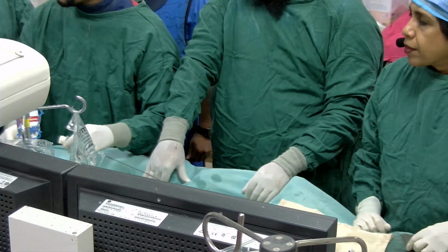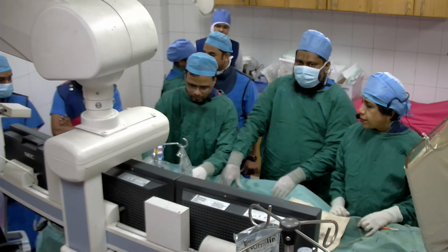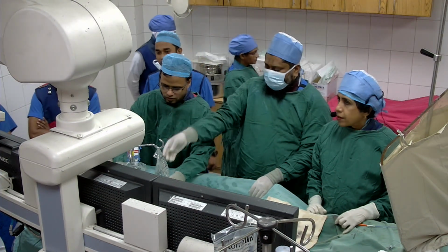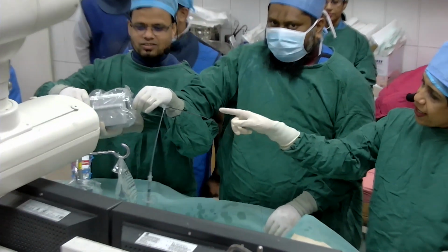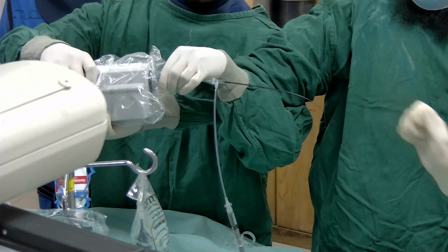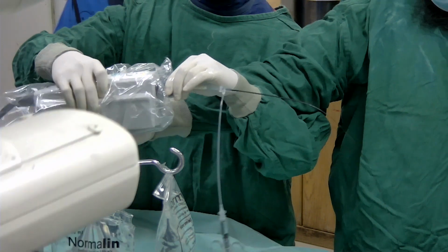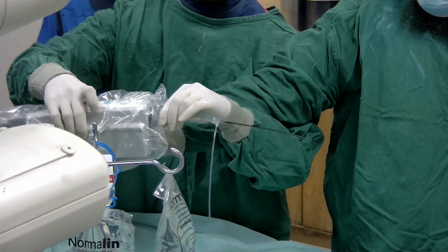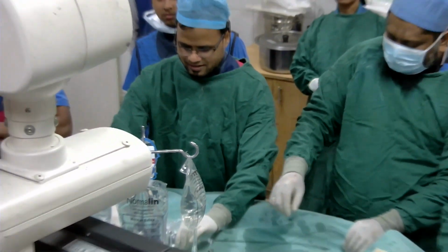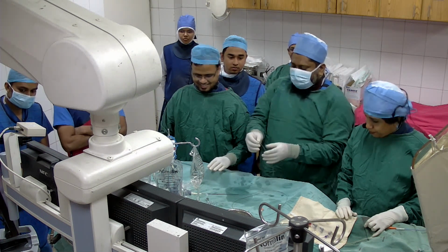We need to connect the catheter with the console. So this is the catheter connected to the console. So he's connecting the catheter to the OCT console. And the OCT console has already been covered with a sterile, transparent cover so that he can hold it safely. So now he's connecting it. Okay, right. Great, wonderful. And the machine starts recognizing that we have connected it, and we've done it successfully, right?